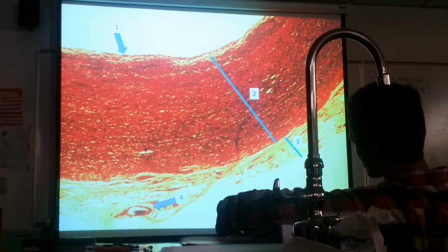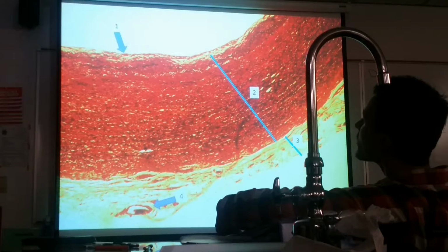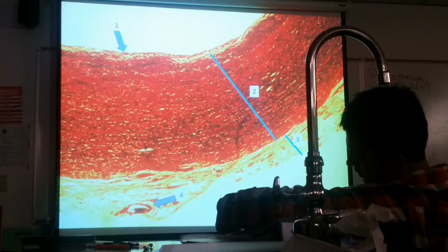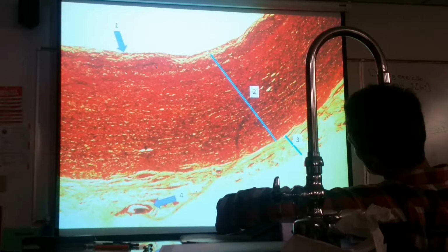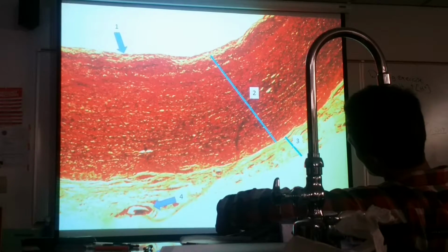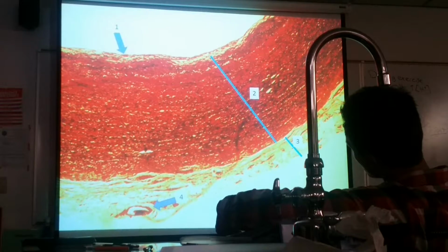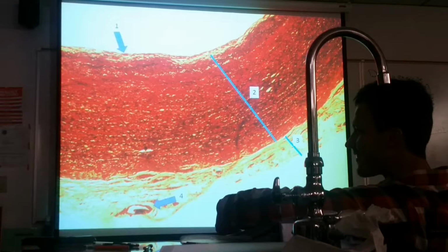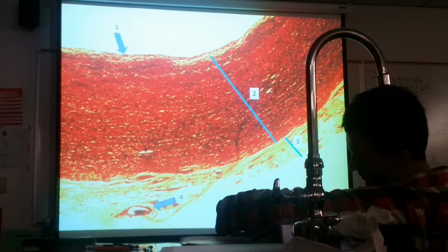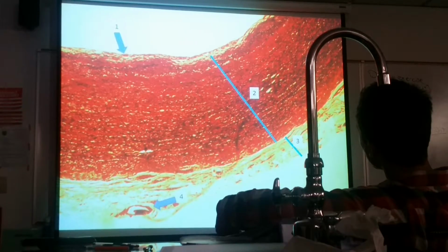You know, there's a structure in the tunica intima. It's called the internal elastic lamina, but I don't know if I'd use this slide as an example because I can't see it. I might ask you the tissue types within tunica media. It's elastic fibers and smooth muscle cells. In tunica adventitia, there's also elastic fibers, collagen fibers, and also the vasa vasorum. And depending on how I phrase the question, if I say identify layer, I'm going for tunic.